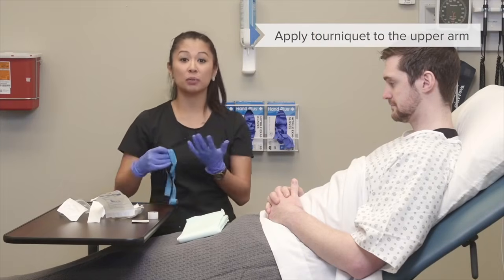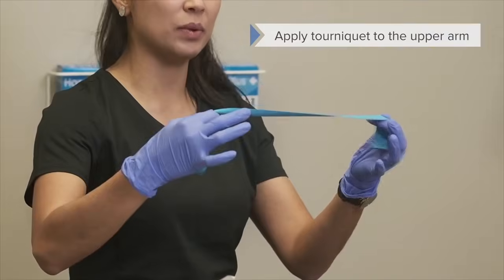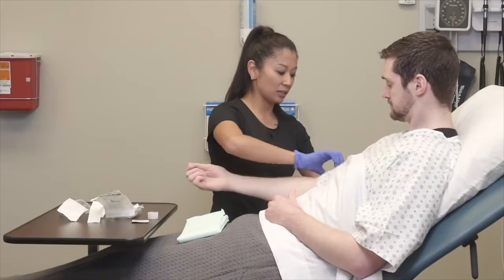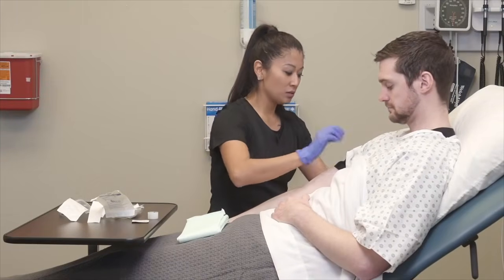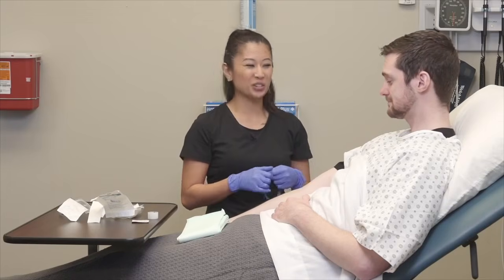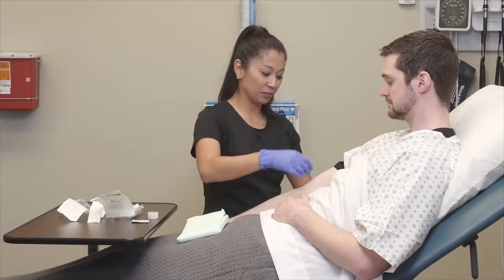So next I'm going to apply the tourniquet, which is this nice stretchy blue thing that's going to come into your kit. This is what's going to help apply pressure to the arm. So when I apply this to my patient's arm, know that once we apply it, it's going to be a little bit tight. So you may want to forewarn and let your patient know about this. So here's the key when we apply it.